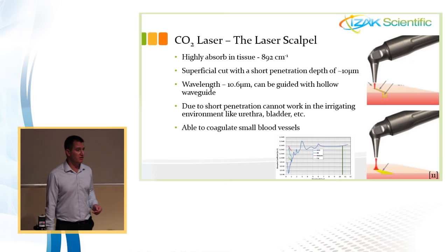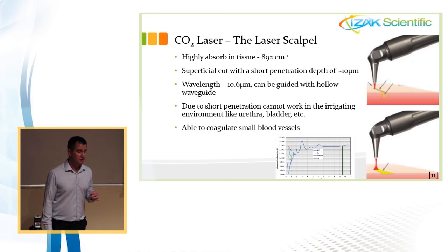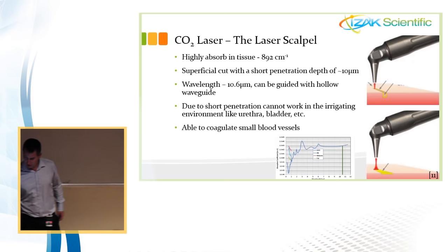But there are a lot of other applications that can be used. This image that you see from the side is from a company called the Laser Scalpel, that used it for dentistry. And the main advantage is that the laser can also coagulate blood vessels, which is very, very important. Let's see a short movie that explains it.